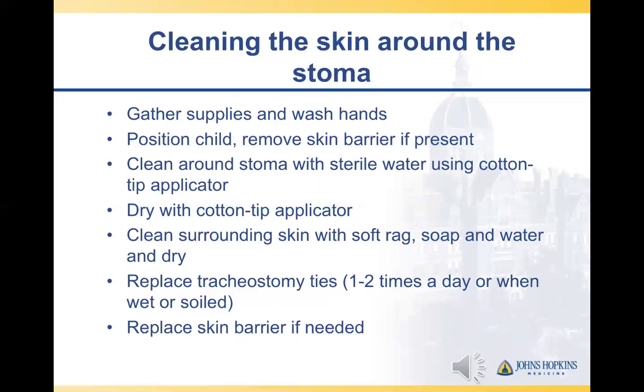As you clean the neck and stoma area, be sure to check for signs of redness, drainage, rash, dampness, or an unusual smell. These problems should be reported to your child's doctor.